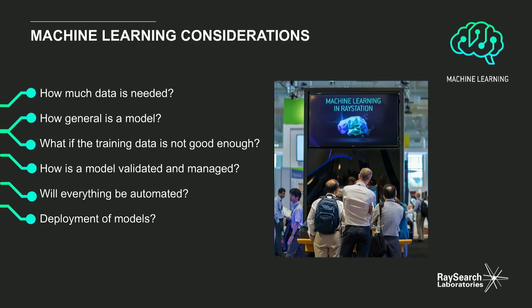How is a model validated and managed? We believe that a model should have the same approval structure as a treatment machine. There should be certain roles for training machine learning models, and this person should be responsible for the training, model management, and model validation. This would be a very important role at the clinic going forward. Of course, in the early days when we roll this out, we will support training models at the clinics, but in the end, this should be driven by the clinics.